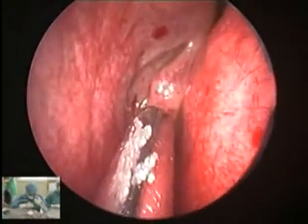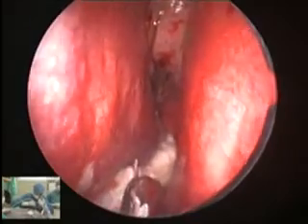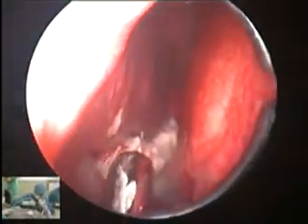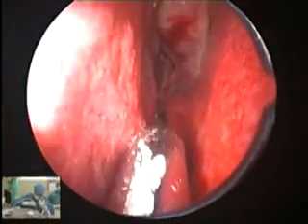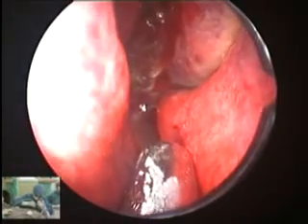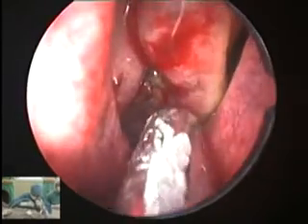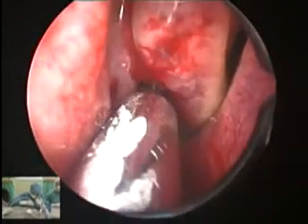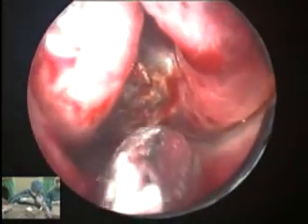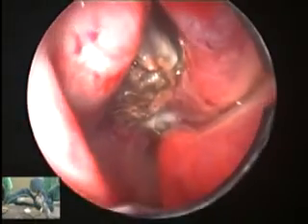So we started by looking at some of the anatomy here. The septum is quite all right here, until in the mid-nasal area we start seeing a spur here that I may have to take down. Further back, middle turbinate, uncinate process on the lateral wall, and we start seeing the fungus material protruding into the nasal cavity.